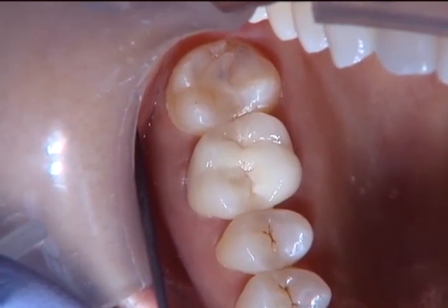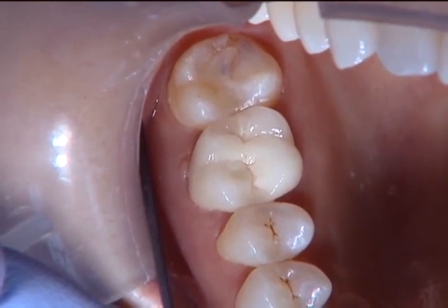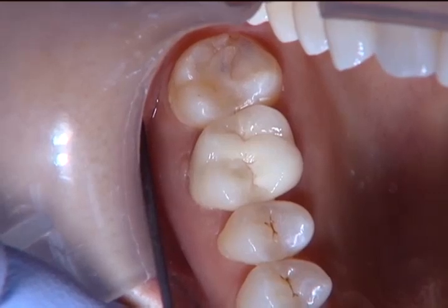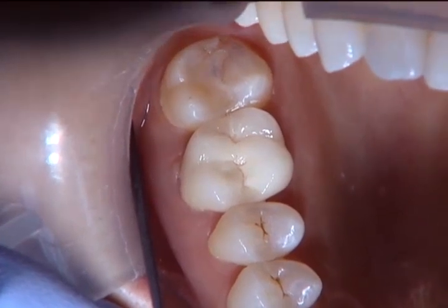And here's an occlusal look at the cemented restoration. And you can see it's a nice looking crown. It looks good. It's got good margins. If you take a radiograph of this, you'll notice that it's very dense. The coping material is indistinguishable from metal. And that always makes me feel good. And again, I've never seen one break.